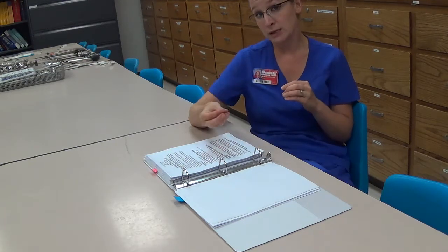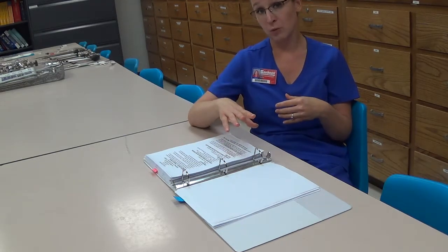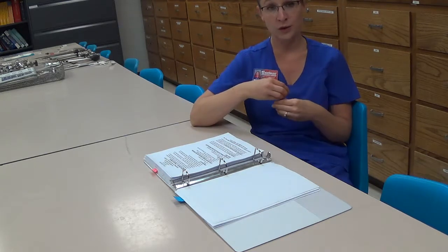And then show them, make sure that they understand which end is getting tossed off, which end is kept up on the field. Talk to them about not dropping it off and giving too much away, that it's always better to keep too much rather than to toss too much off, because you could always give more away, but you can't pull it back up onto the field. Just watch their hands, making sure they're not getting too high, too low, or reaching behind them.